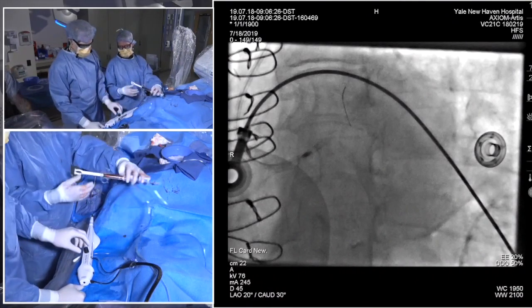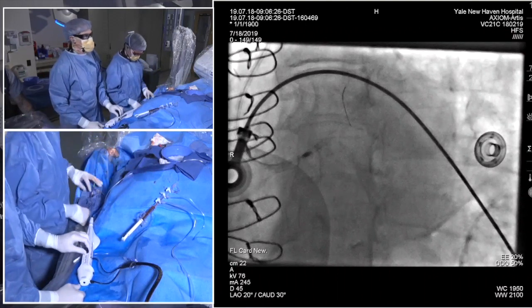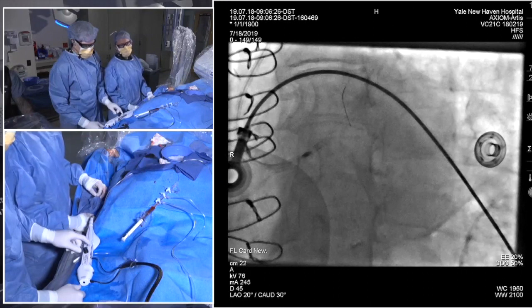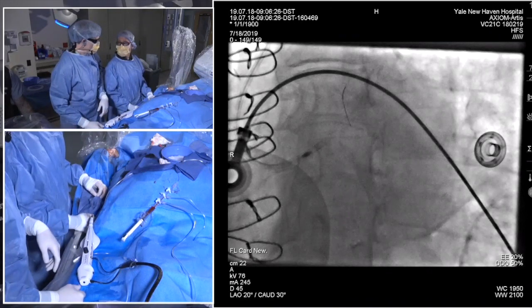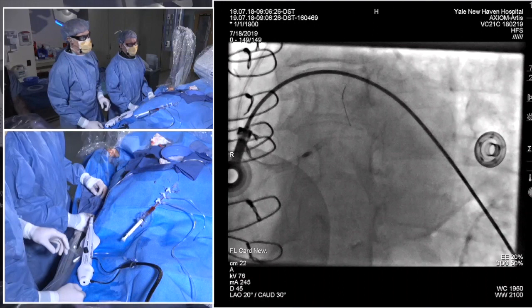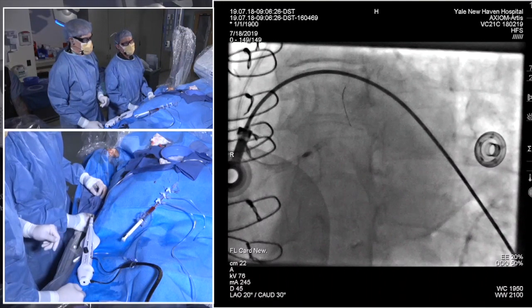I think if you don't have a good definition of the disease in the iliacs, and particularly if she's got a history of peripheral vascular disease, I think you want to know that. You just want to make sure that if you get into a situation where the patient is decompensating quickly, that you can quickly get an Impella in. Getting an Impella in under 5 minutes is relatively easy if they don't have peripheral arterial disease.